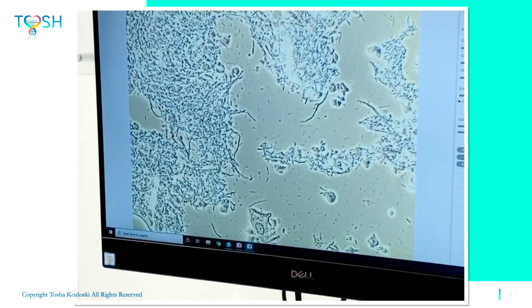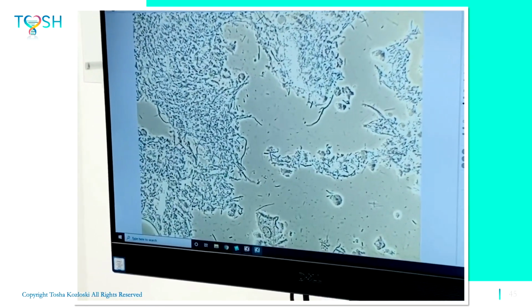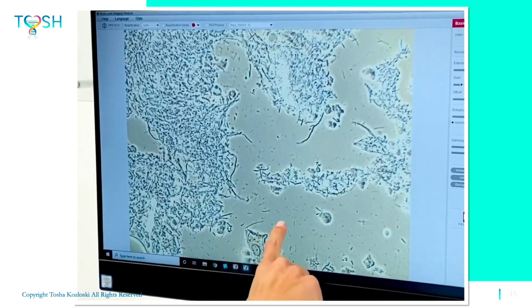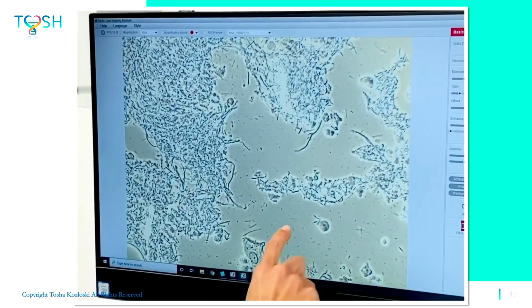They're also an anaerobic bacteria. So once we take them out of your mouth, they die pretty quickly, which is why they're kind of hard, like they're not really swimming around like the spirochetes. They can still live in oxygen for a little while, so that's why they're swimming around on there.